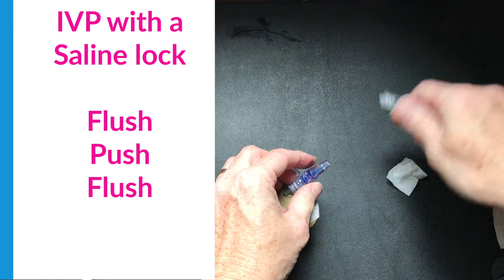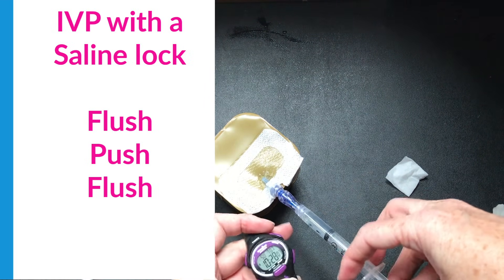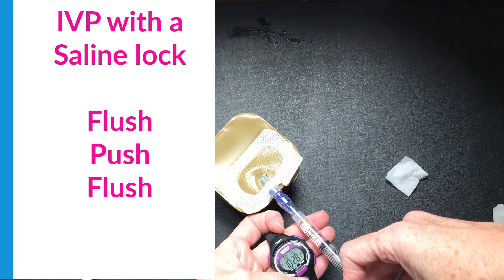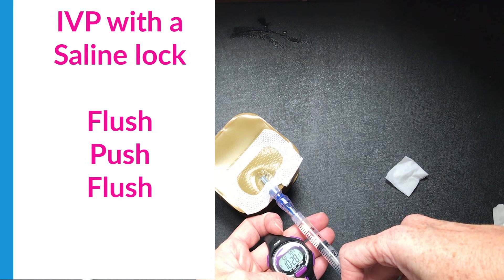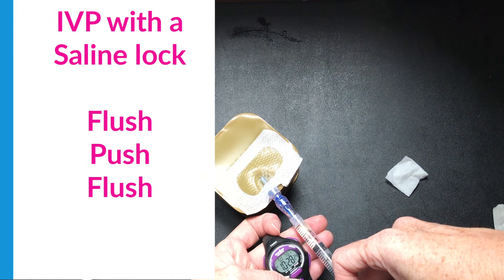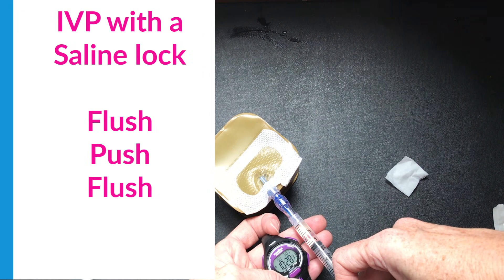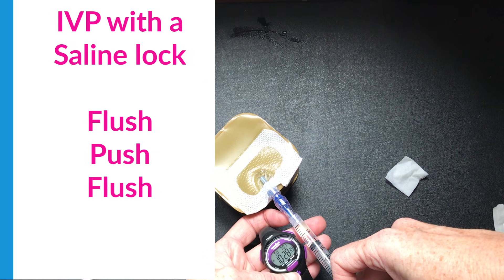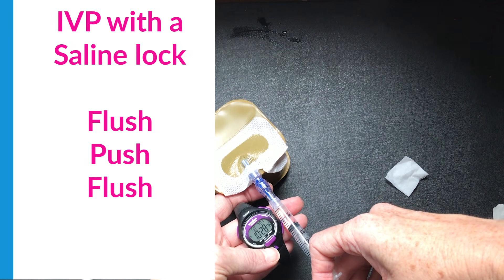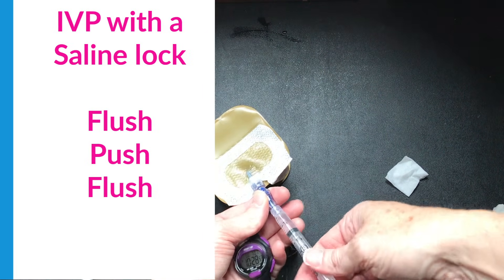I need to clean for 15 seconds again, then attach my medication, get my watch ready, and use the same method. I'm going to turn the syringe so I can see the lines. At 15 seconds I push in a tenth of a mil and wait, then push in the next tenth at 30 seconds, and the next at 40 seconds — so I'm doing something a little bit at each step of the journey, but my patient is getting their medication in a safe manner.